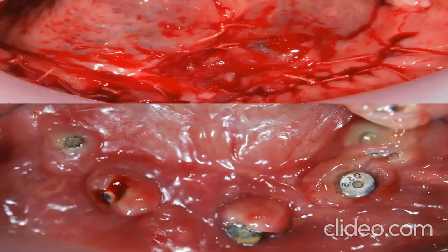Now, the other challenge: I did a frenectomy at the same time. The patient was happier with that than probably with my implants and the big surgery I did for him, because he can move his tongue and talk better. But look at the soft tissues. At first instance you say, oh my God, what's going on? Even the surgeon who did the mandibular section told me there is a bit of peri-implantitis and inflammation. But that's normally what you get around implants, especially when you don't have keratinized mucosa.